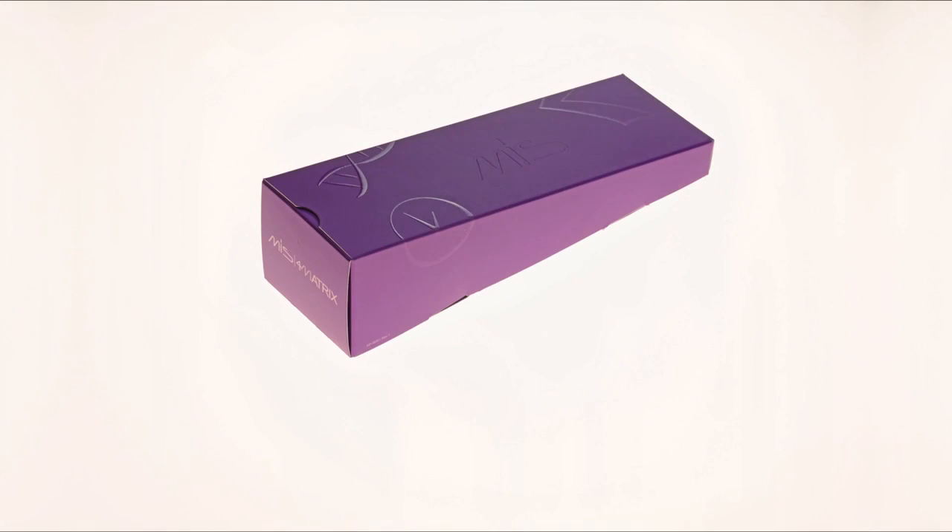Formatrix is an innovative, patented, synthetic bone grafting cement developed to simplify dental bone grafting procedures.